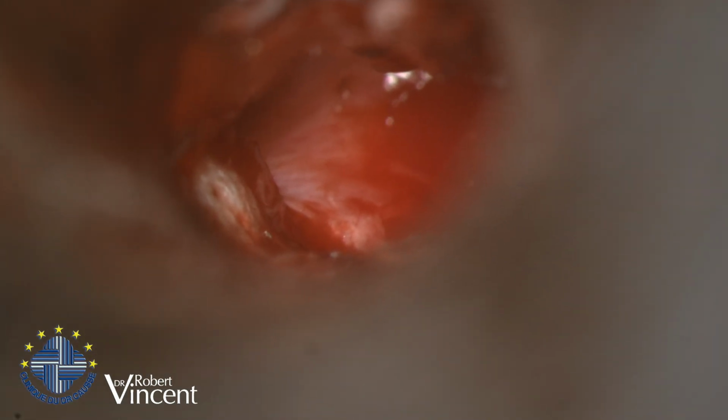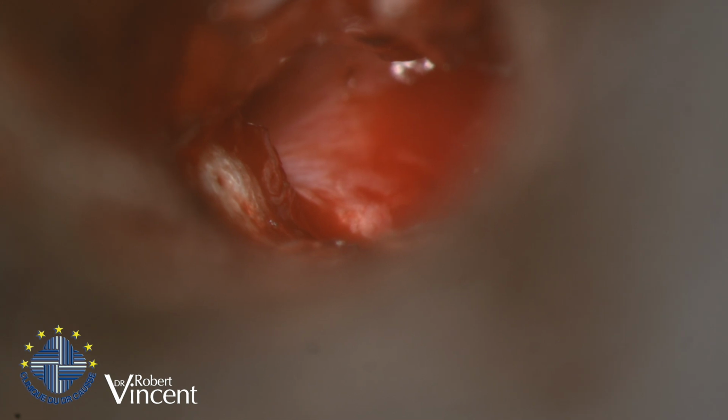Okay, good. I think we will have to put in a malleus prosthesis, that's all for now. So if I put a Malleus prosthesis, I think I need to take a piece of cartilage because I think the one which was used is not really good. Yes, three more, please. We take out the malleus prosthesis. Yes, go ahead.